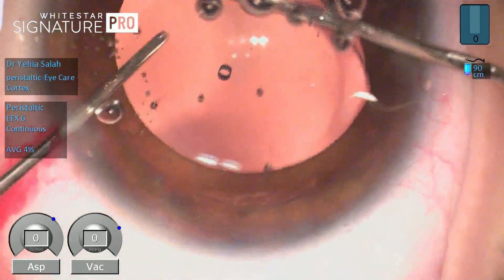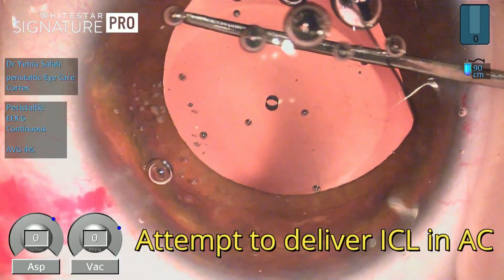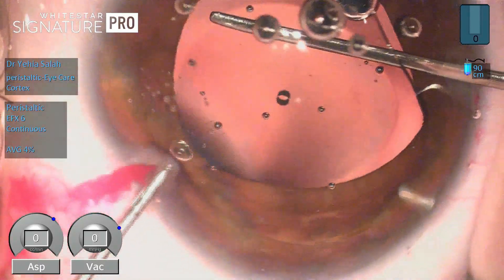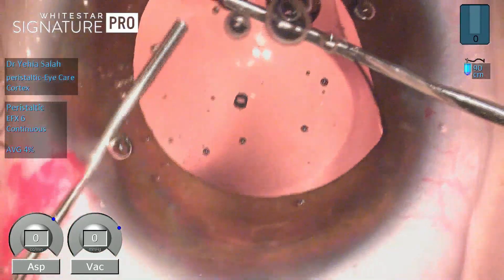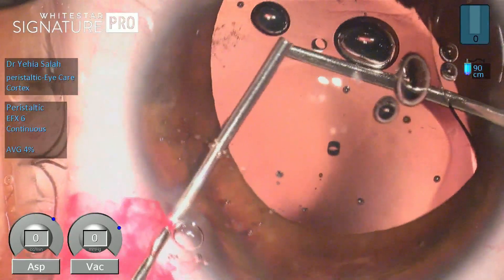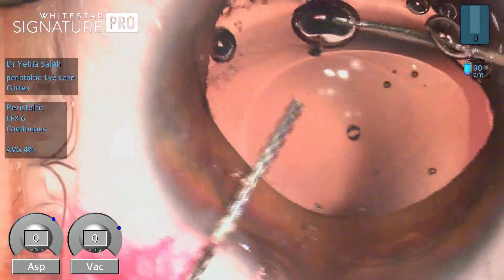The first step was to inject cohesive viscoelastic through the port to separate the ICL from the anterior surface of the lens, then deliver it into the anterior chamber. At all times you should be careful not to insult the corneal endothelium or the anterior lens capsule — careful manipulation and copious amounts of viscoelastic when needed are very important.